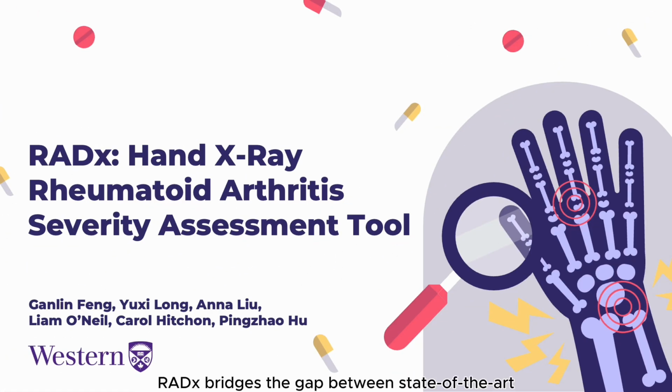In summary, RADx bridges the gap between state-of-the-art computer vision and clinical rheumatology. We believe RADx sets a new standard for automated RA assessment, ultimately improving patient outcomes through earlier and more accurate intervention.